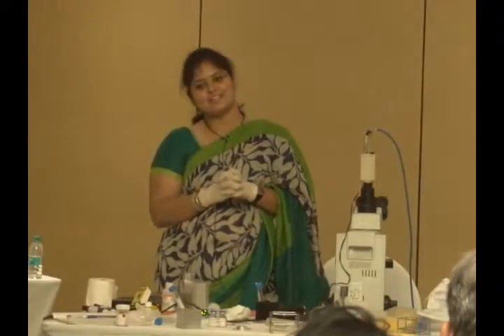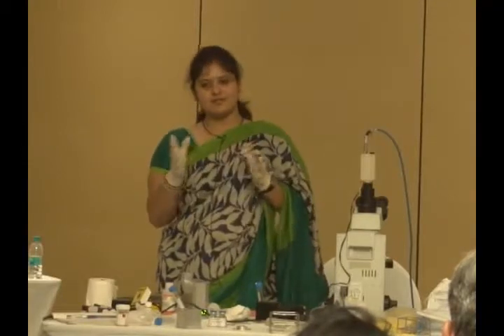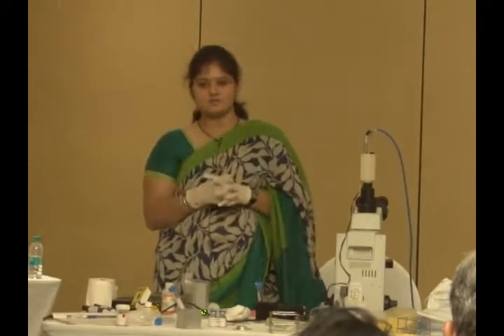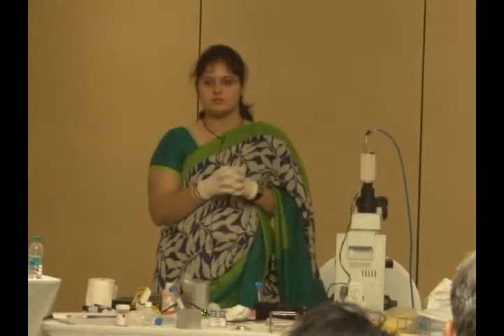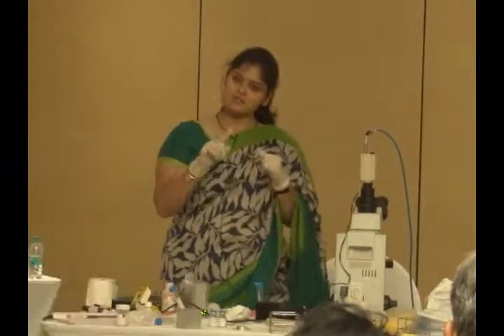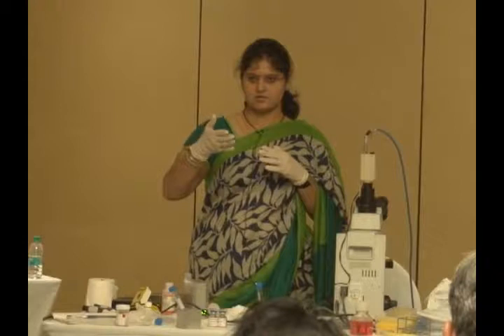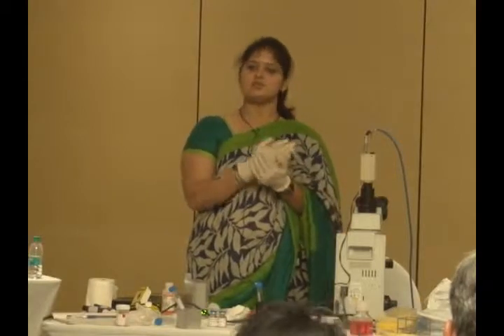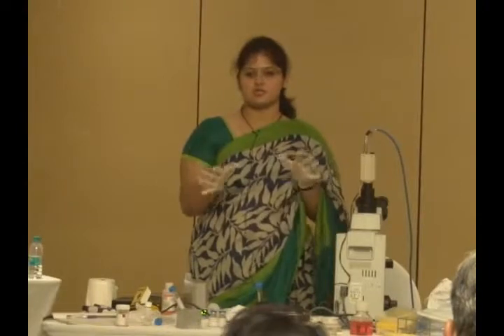Ideally, you should not take samples from clinics which are very far away from your lab. But at least within half an hour, the sample should reach your lab. After processing, you can examine it within half an hour, but before processing also, it should reach your lab within half an hour. So in another 45 minutes, you will complete your procedure.